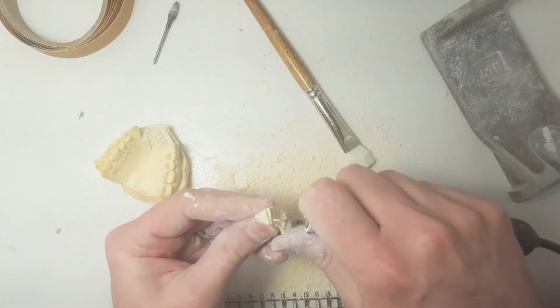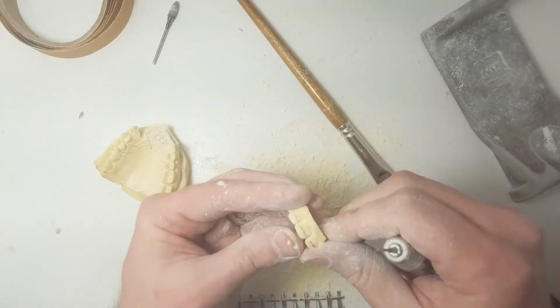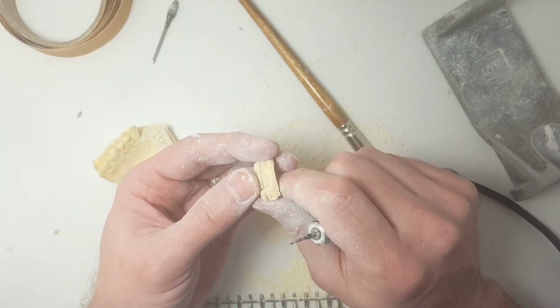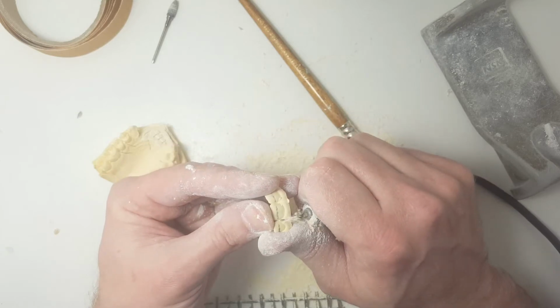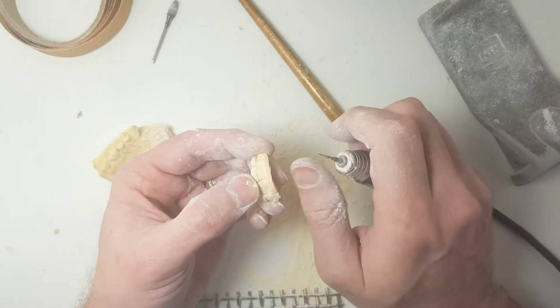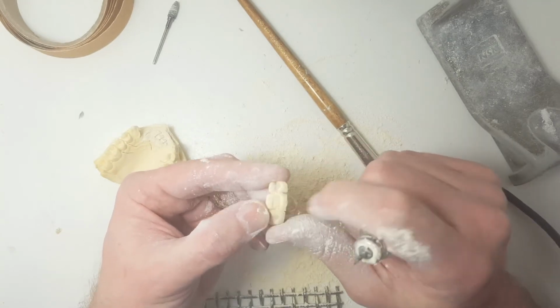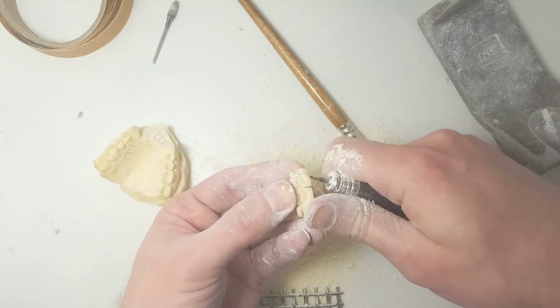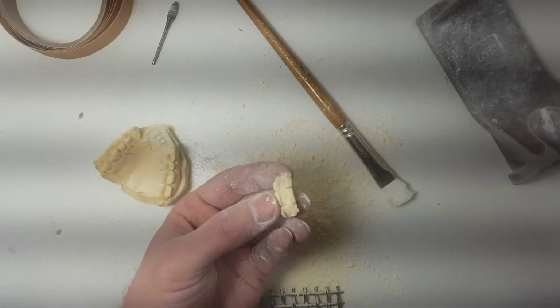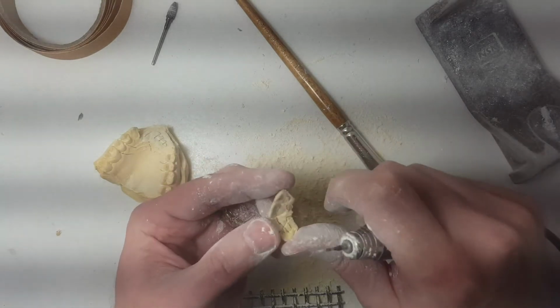So I'll do the same thing in the upper. Let's cut a little wax groove underneath. And then do the same thing again. I'm going to do it a little different this time. I'm going to do all the facial first. And again, I'm just trimming out, and I'm at this angle. If you can see that angle. Lines are back, but it looks like it's zooming. I'll leave them for right now.